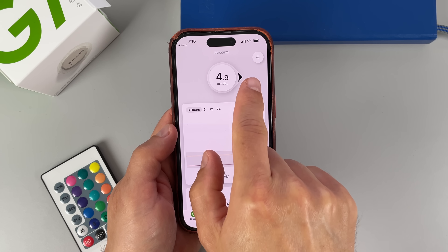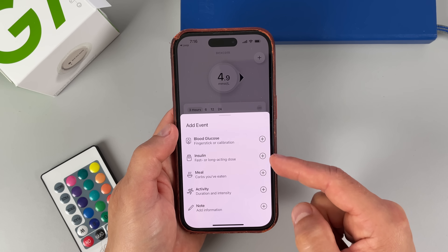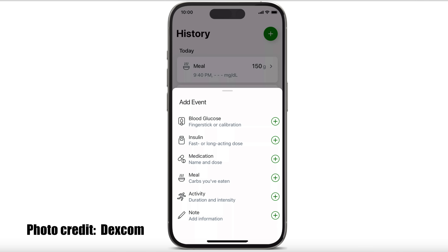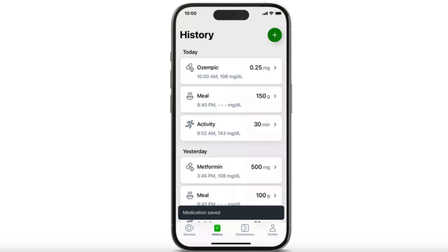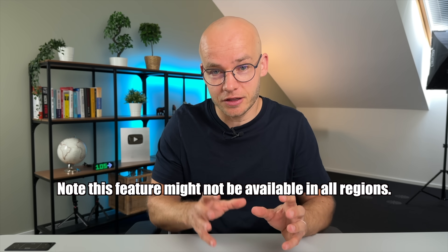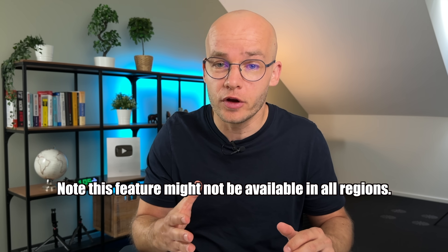Now let's talk about something exciting — another update to the Dexcom G7 app. If you watched my G7 review, you'll probably remember the handy feature where you can add events like insulin, meal, or activity in the app. This feature has improved because you can now add specific medication other than insulin. I think this will be helpful especially for those on metformin or GLP-1 drugs like Wegovy or Ozempic — you'll be able to track all these directly in the app and have a better view of how these factors improve your blood sugar graph.